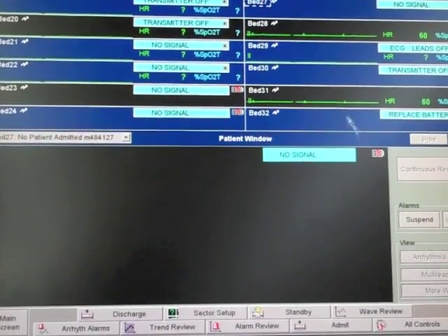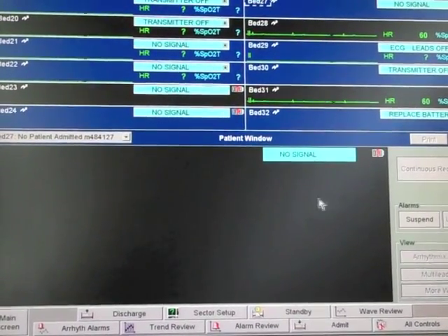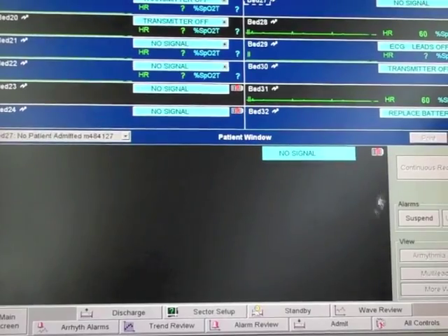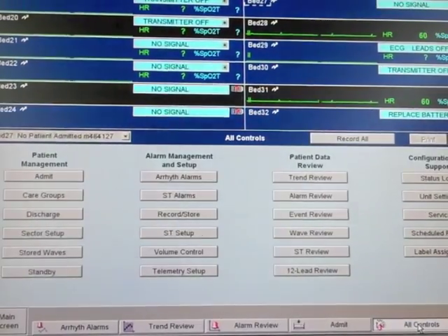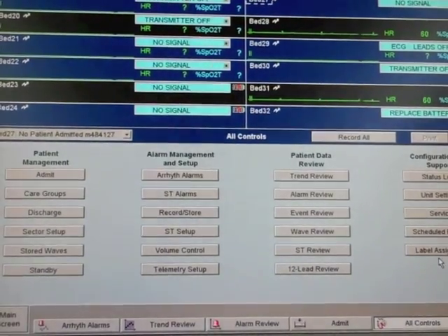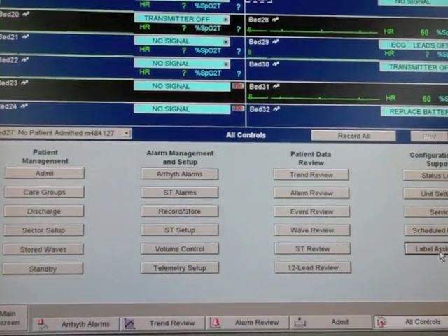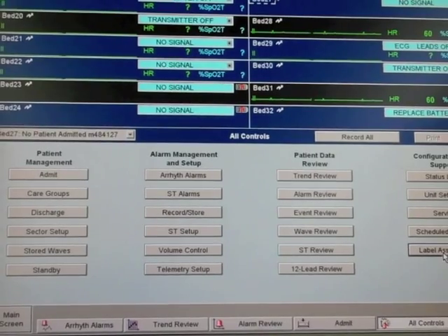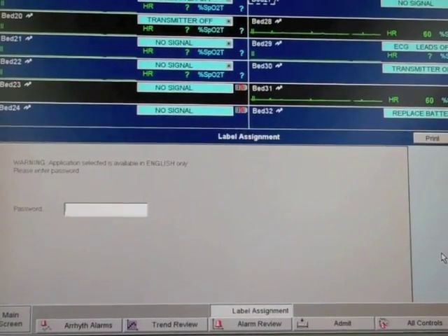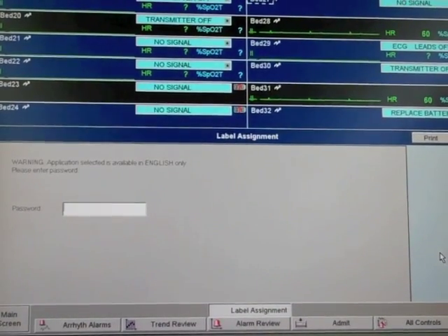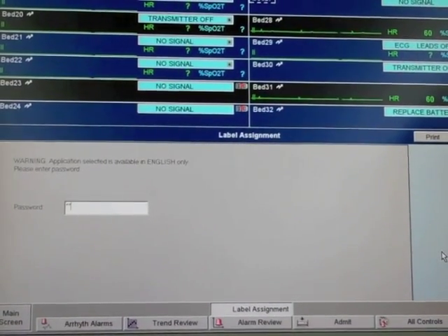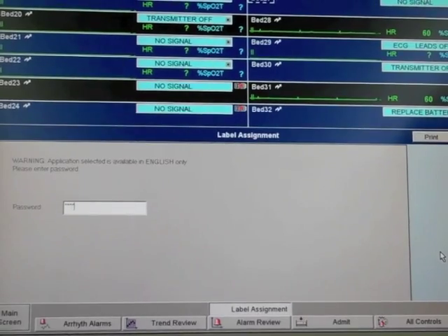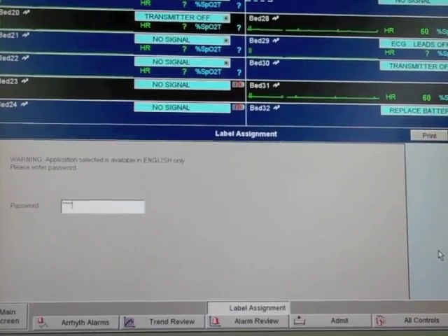Then you want to go to your central station and get into your programming. You want to click all controls under configuration and support label assignment. Your password will be tele, T-E-L-E lowercase.